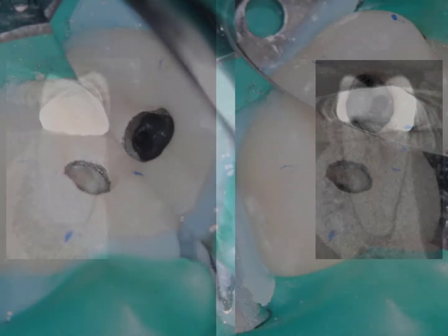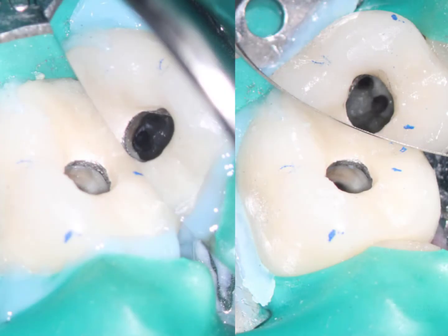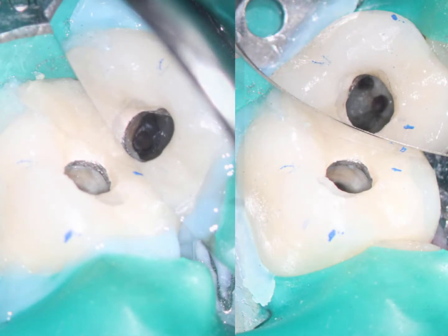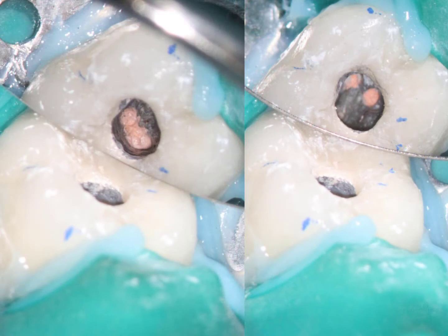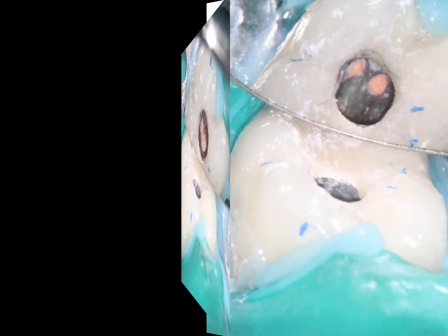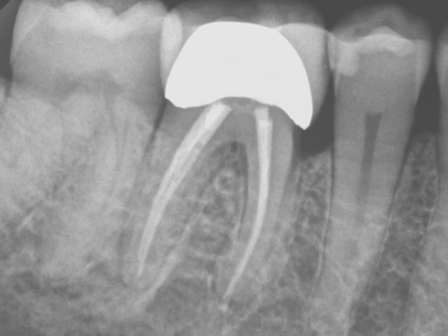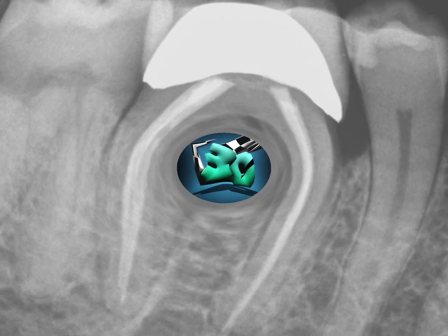Following the diagnosis, treatment was initiated. Four canals were located, and the mesial and distal canals appeared to be roughly parallel. I felt comfortable with the case, and the final x-ray did not give me any cause for concern.